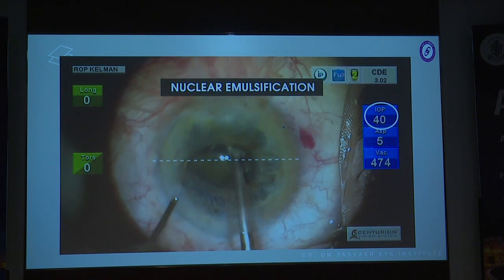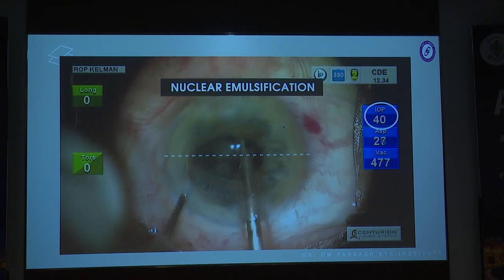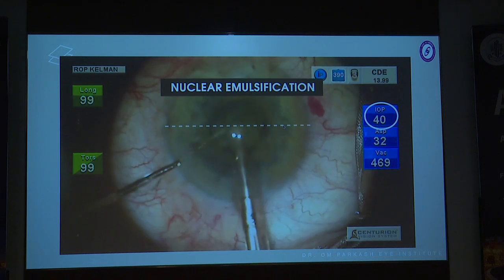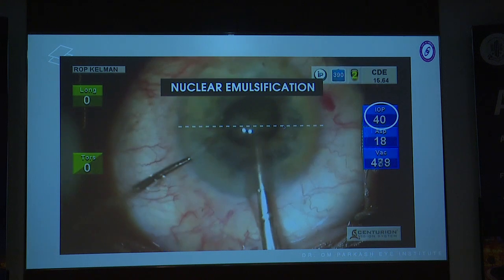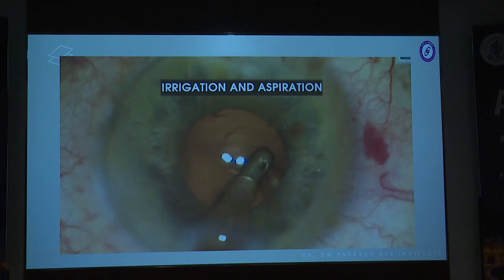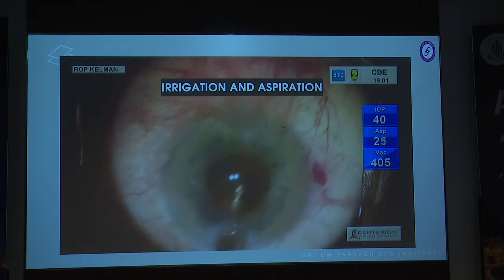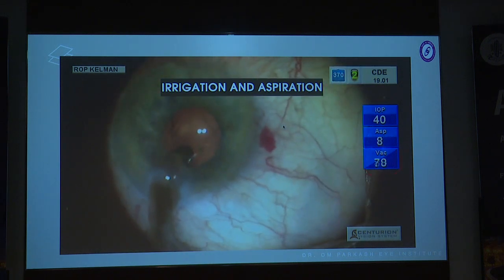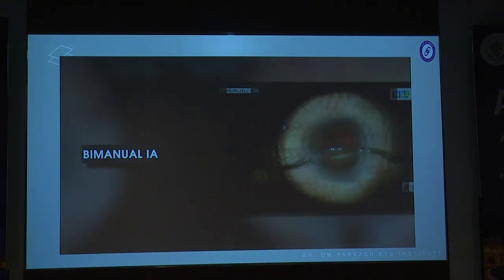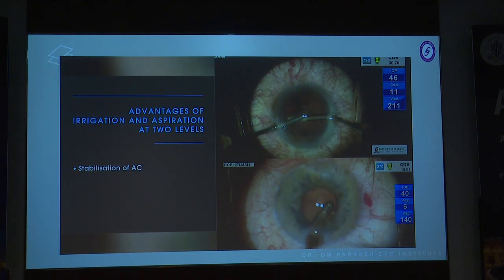Nuclear chopping of grade 2-3 nucleus sclerosis is done using selective vacuum at a deeper plane for firm gripping. The aim is to chop into small nuclear fragments with total separation. This provides a stable anterior chamber and capsular bag and decreases excess fluid to the posterior aspect of iris. Firmly gripped hard nuclear fragments are brought to the level of the anterior capsule. Emulsification is done in the center and proximal half of the pupil to avoid inadvertent emulsification of iris. Irrigation and aspiration is done using a curved coaxial tip with sleeve highly retracted.